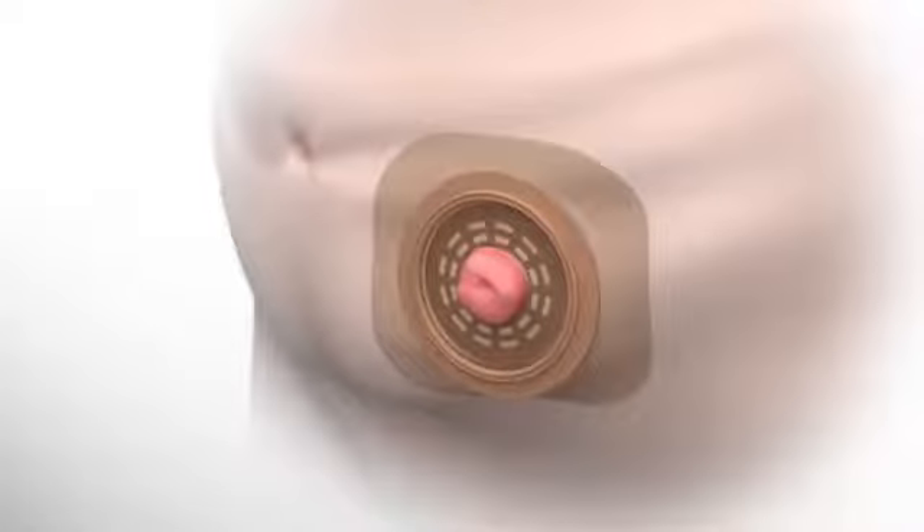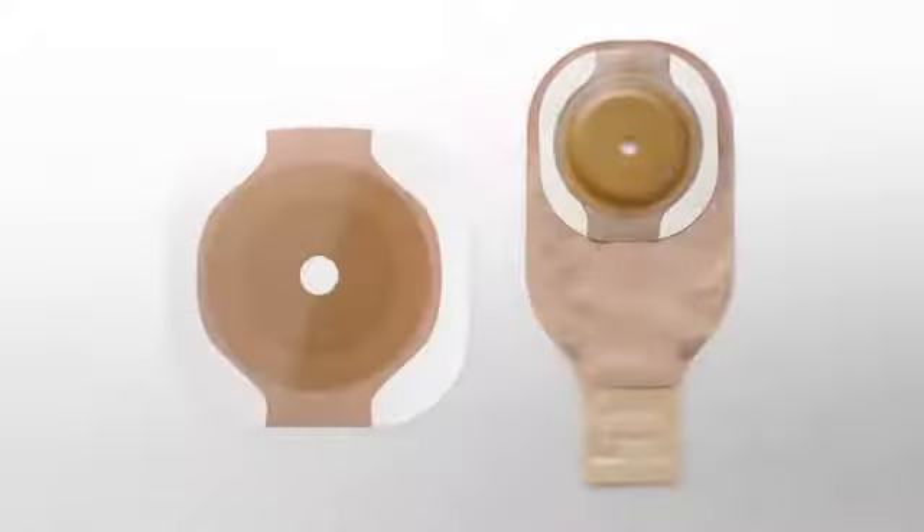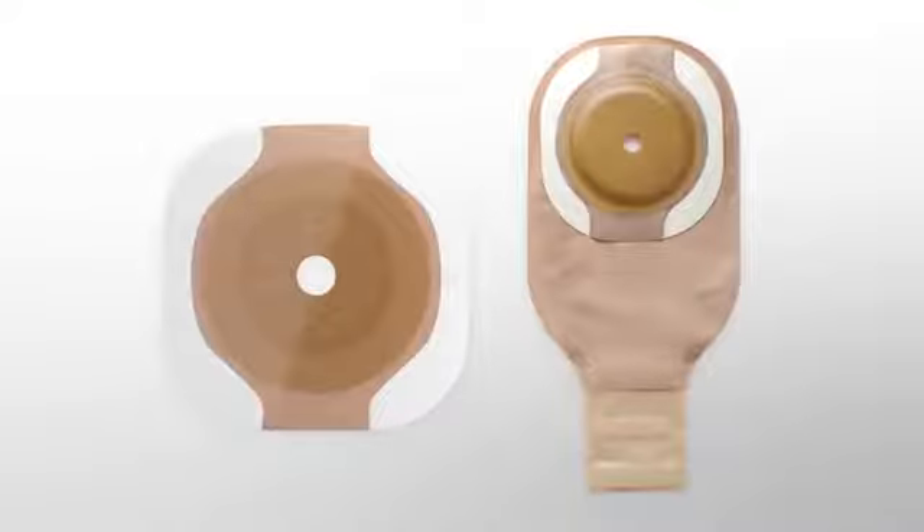It easily conforms to fit abdomens with skin irregularities, creases, and folds. Plus, the adhesive border barrier is available with most Hollister Ostomy one- and two-piece pouching systems.